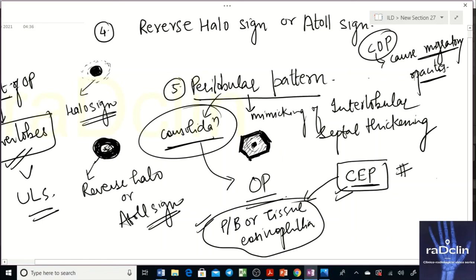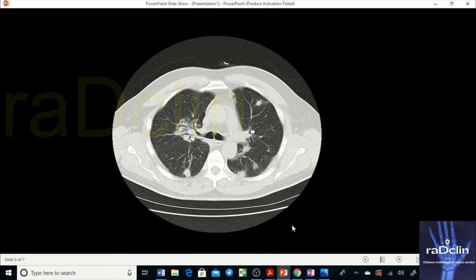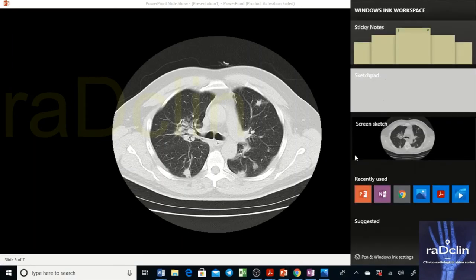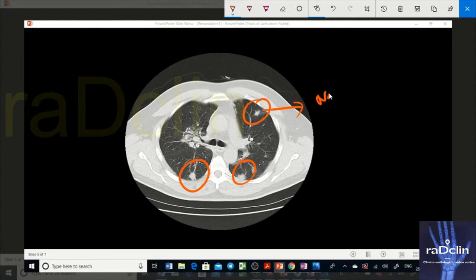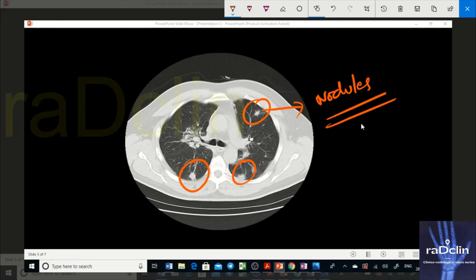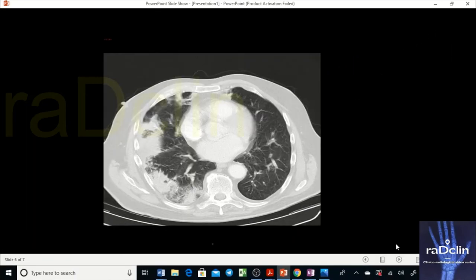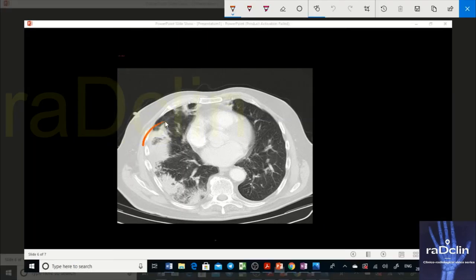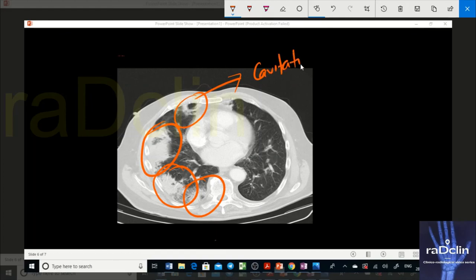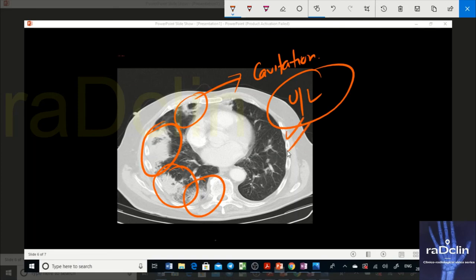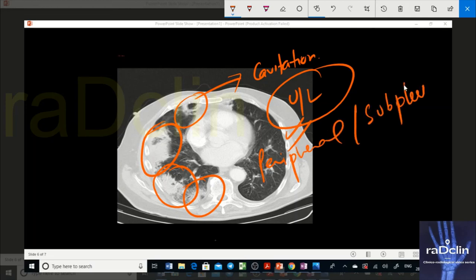Looking at the images — in this image you can clearly see the subpleural area getting involved with subpleural peribronchial nodules. These appear as small nodules only. In the next image you can see large areas of peripheral consolidation, and there is also cavitating consolidation seen here, with a unilateral picture.